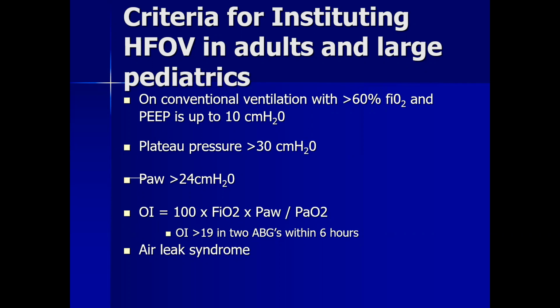After that came out, other studies questioned, hey, wait a minute, maybe they're dying because people typically don't use an oscillator until it's the absolute last possible thing to try to save somebody. So they're already dying. It's like, all right, let's try the oscillator, and then they die.